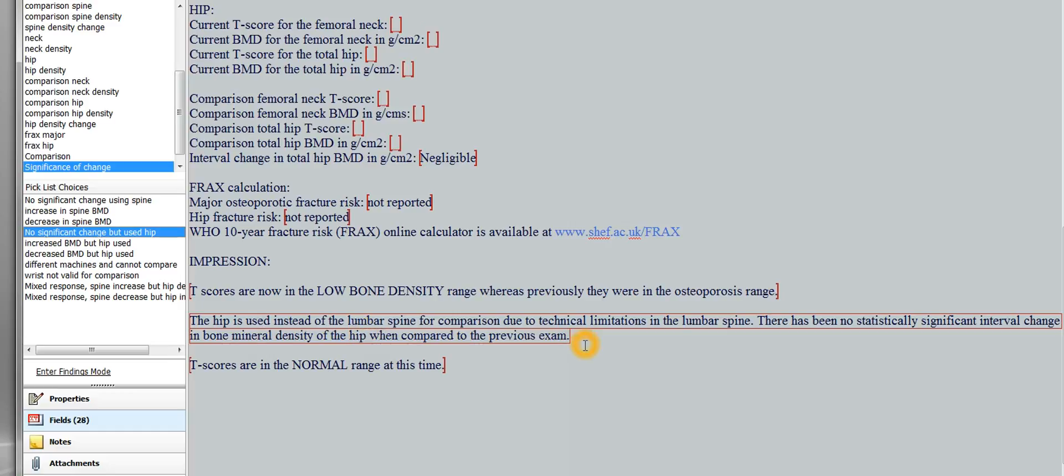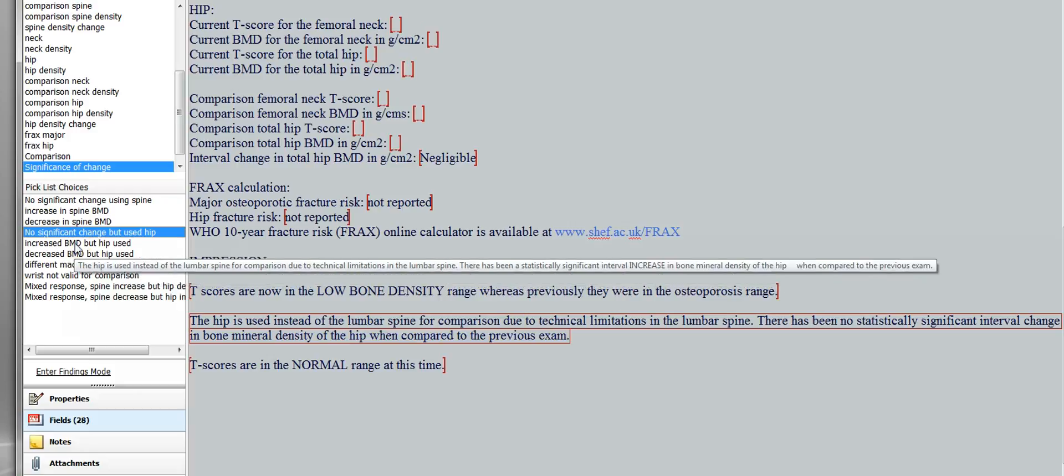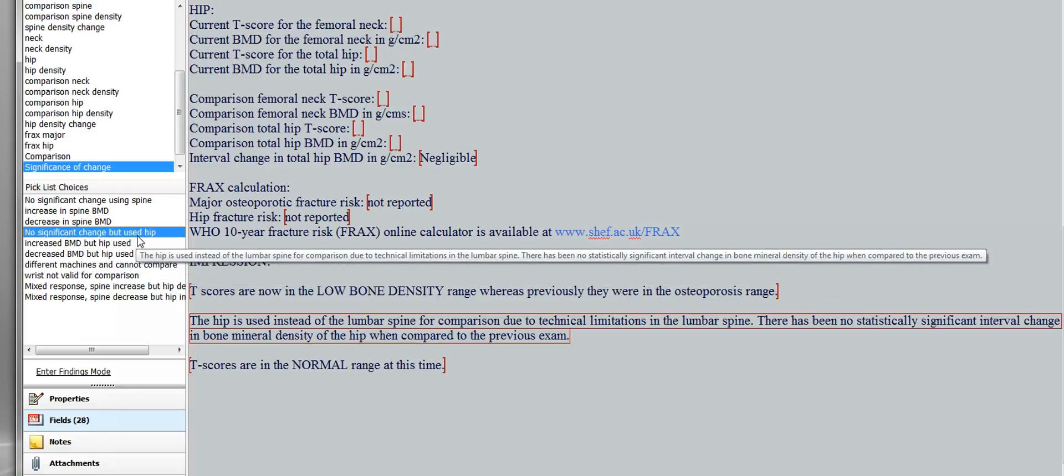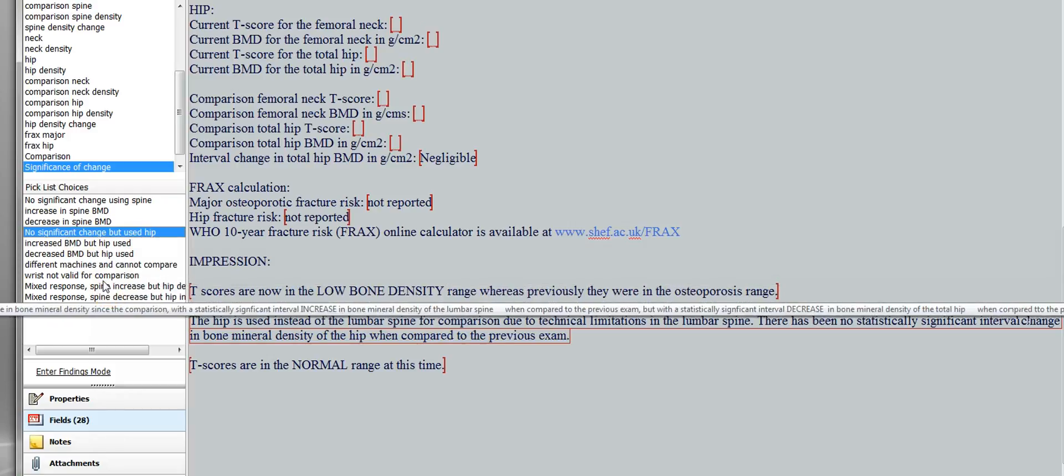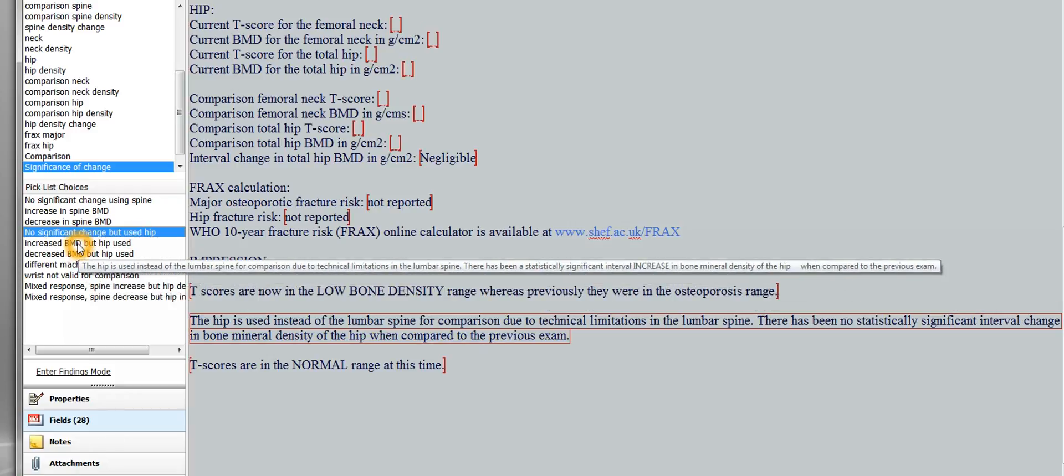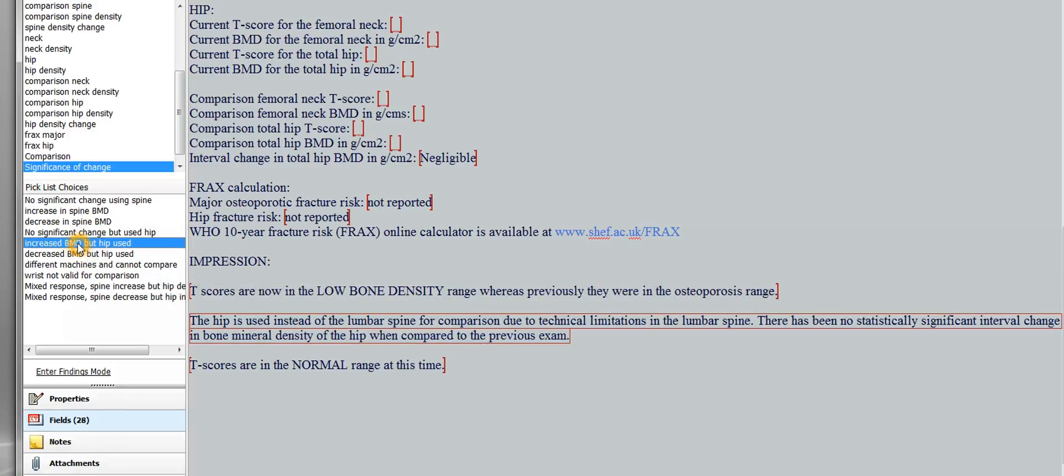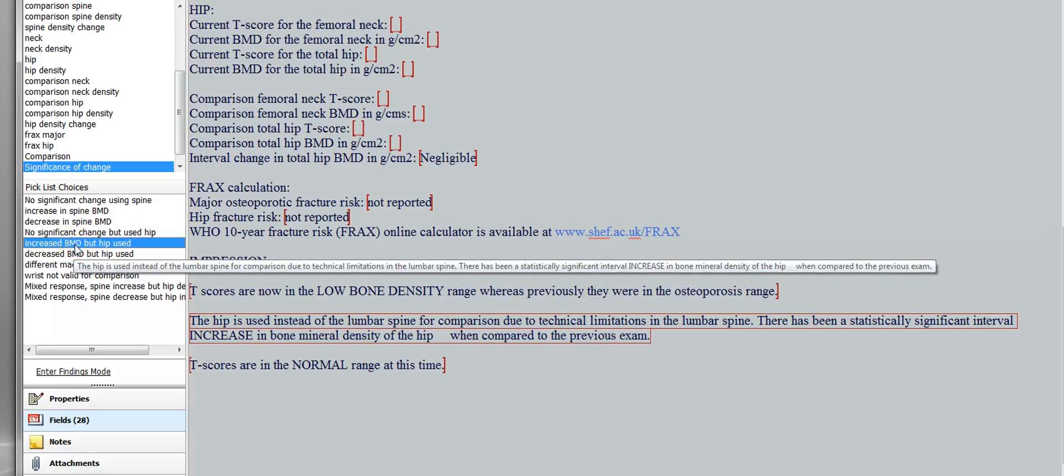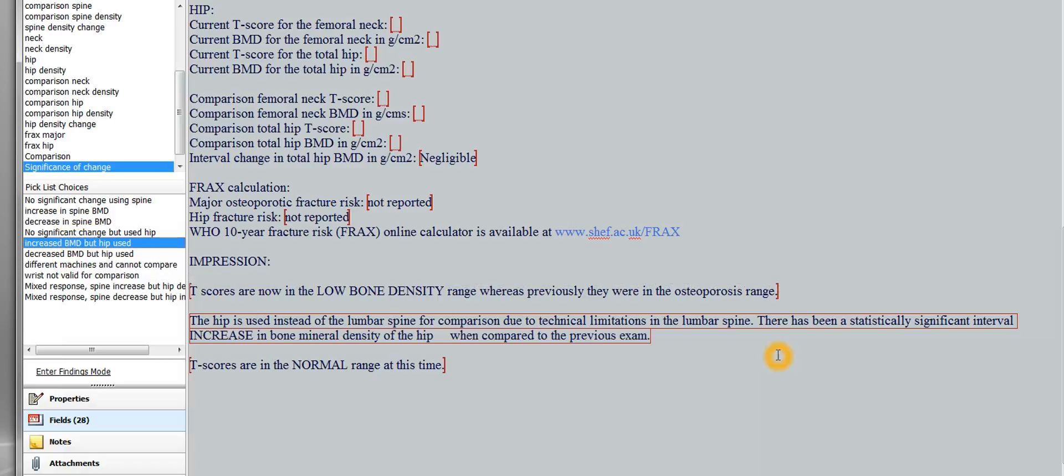So it's basically saying, no significant change, but we're using the hip. And then the same thing if you're going to have a hip, using the hip, but there's been an increase or a decrease. And then again, whenever there's a change, you're going to have a blank here, and you're going to fill it in. So there's been an increase in bone mineral density of the hip of 0.06 grams per centimeter squared, or 3.1%. And fill those in there.